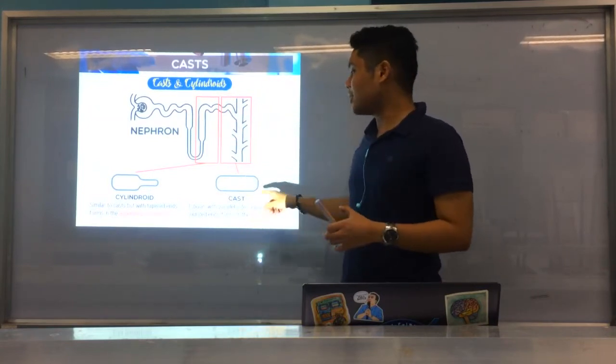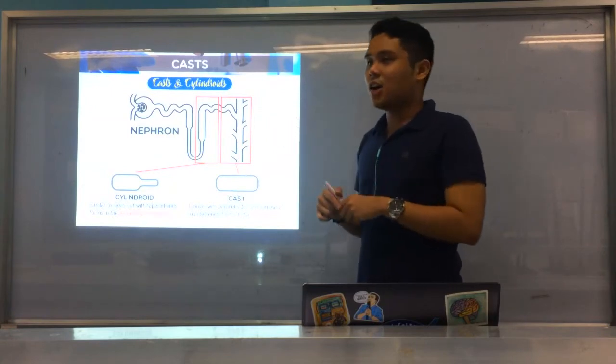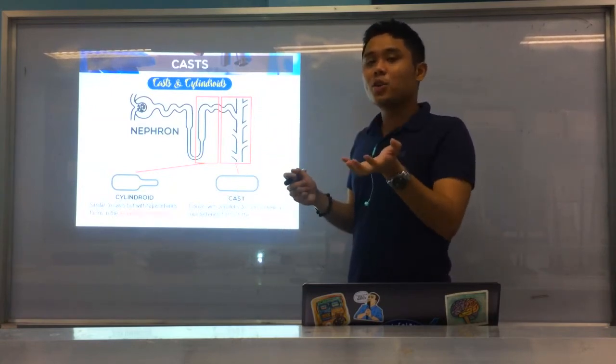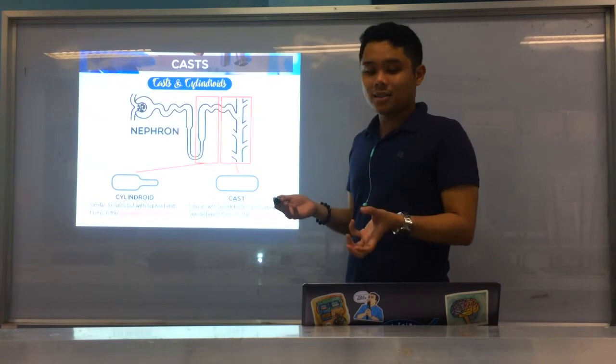That is why ang shape sa imong casts is quite tubular with rounded ends, whereas imong cylindroid is tapered. Okay, all right. But again, they have the same significance. And again, the presence of casts in urine is your cylindruria. Now, let's discuss first how the casts are made.